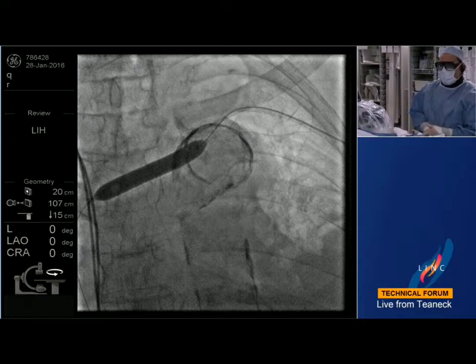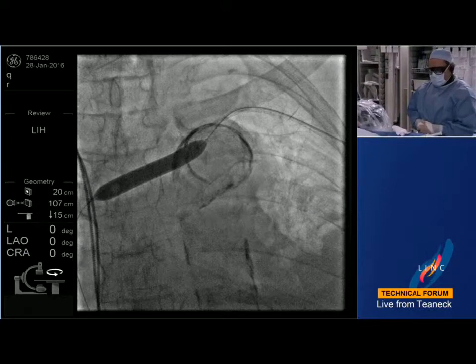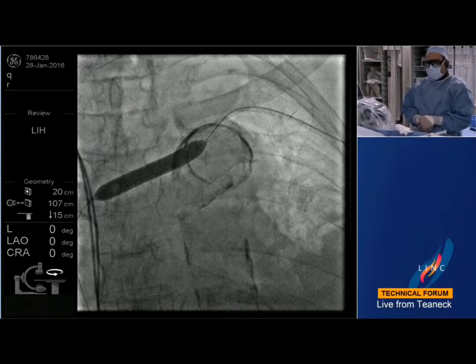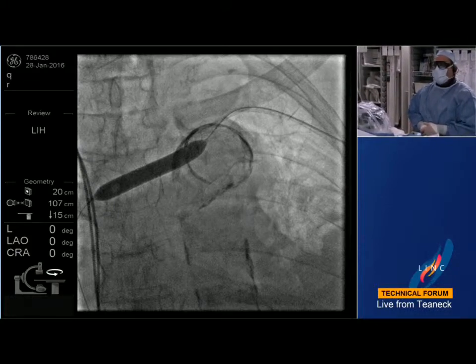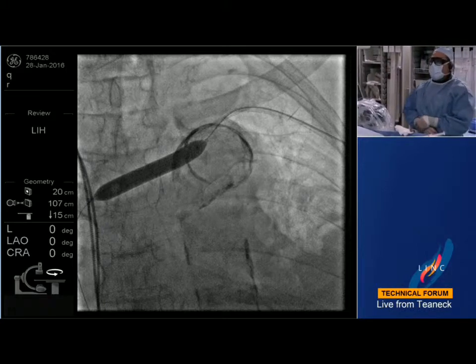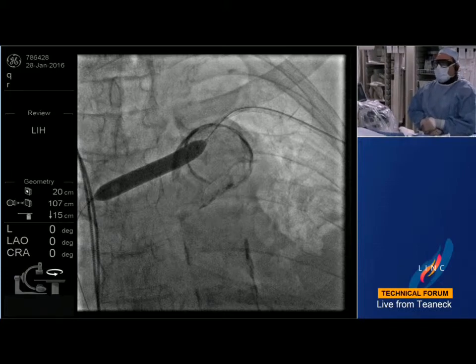Is that an area that you think this might be worthwhile treating? Actually, centrally not, but maybe at the beginning of the cephalic vein, maybe. Centrally, I haven't done that. So we have another minute or so on this inflation, and we shall see.